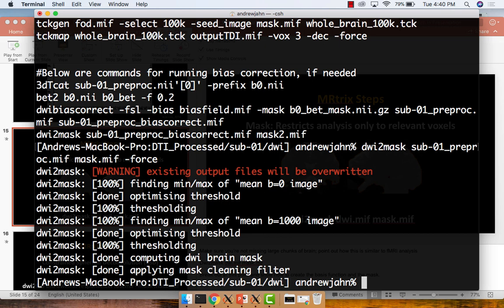From what I remember reading, they do have some algorithm to try to select representative white matter voxels. I'm not sure exactly how they do that, but it's not as though they would accept candidates from, say, the ventricles, I believe. I may be remembering that wrong, but I don't think it's a completely random selection process that it does to generate the basis function. Okay.